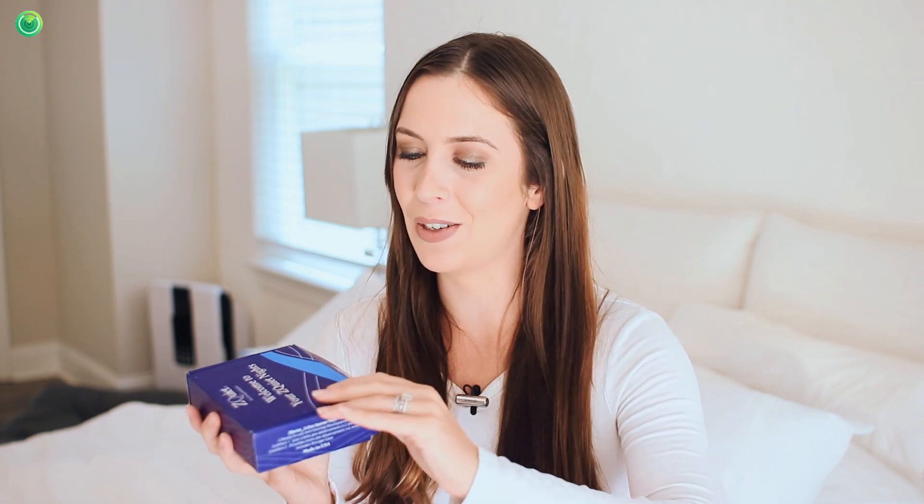Hi everyone, I have the ZQuiet anti-snoring mouthpiece to unbox and share with you. This is voted 2021's most comfortable anti-snoring mouthpiece by the Sleep Foundation, and the best part is there's a 60-day money-back guarantee, so there's no risk in trying it out.